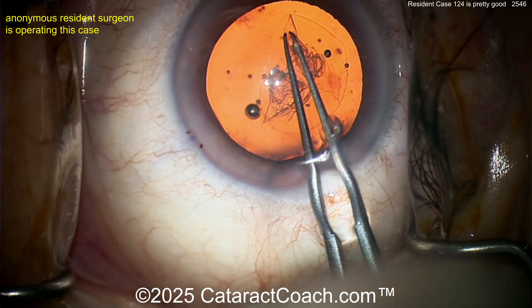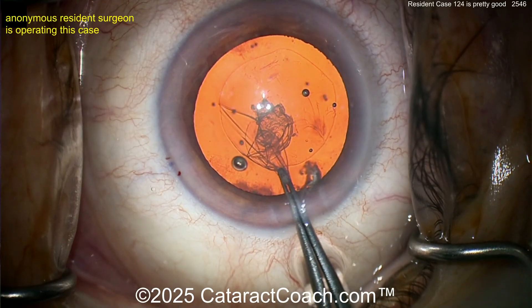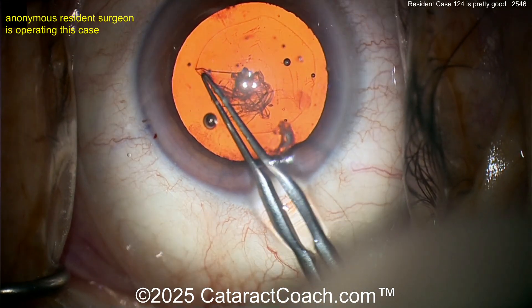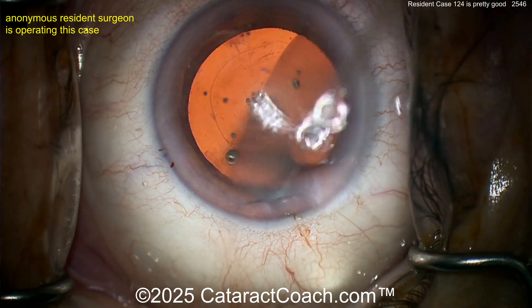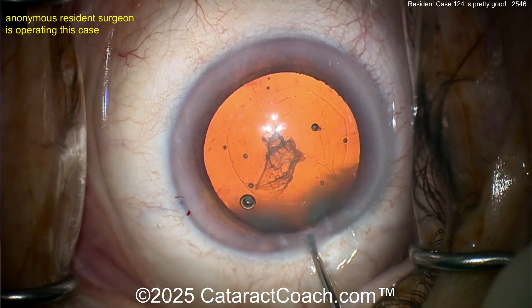The rhexis is very well controlled — it's not a baby rhexis. I was telling you, don't make a baby rhexis. Continuing it, one more grab — you can grab as many times as you need to. And that's complete. It's not really well centered, but I think it'll be sufficient to overlap the optic 360.